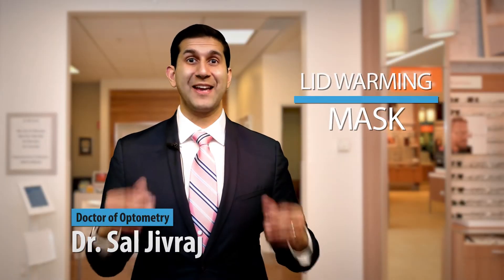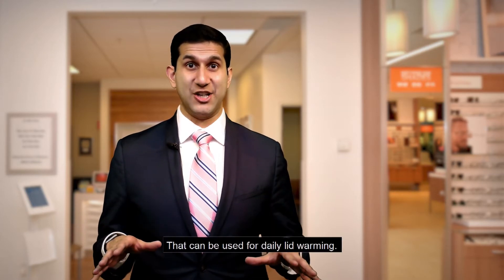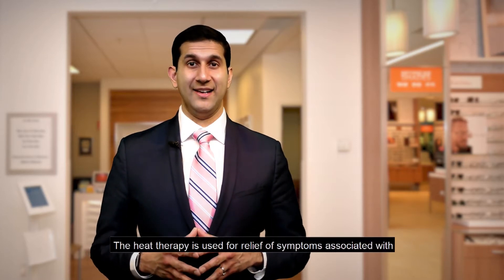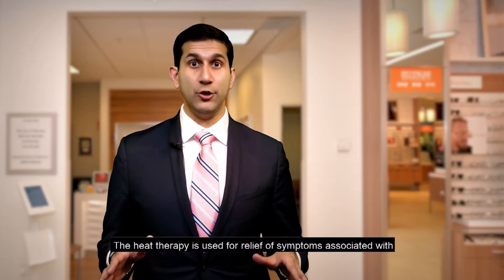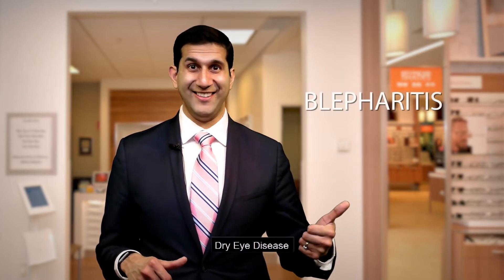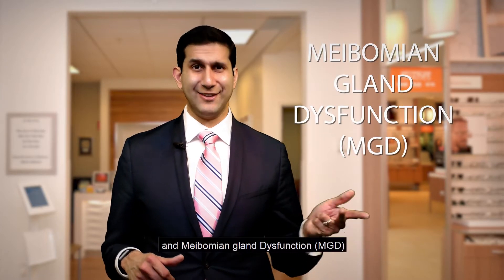Lid warming mask patient instructional video. This is a safe and comfortable procedure and can be used for daily lid warming. The heat therapy is used for relief of symptoms associated with blepharitis, dry eye disease and meibomian gland dysfunction.